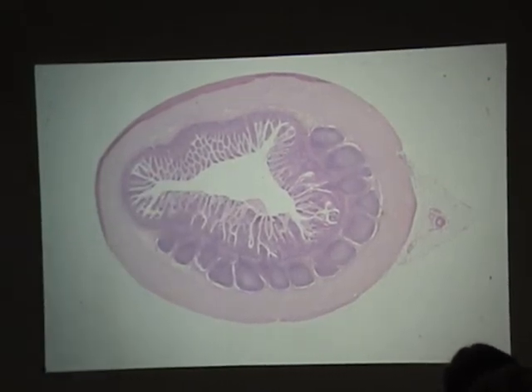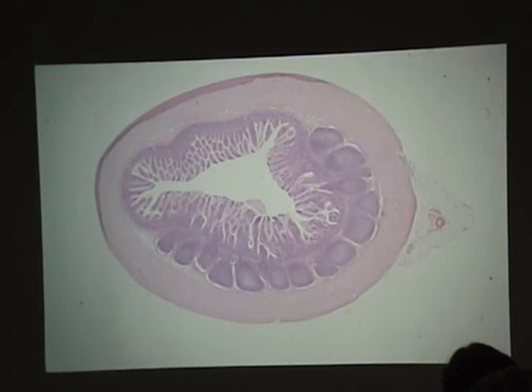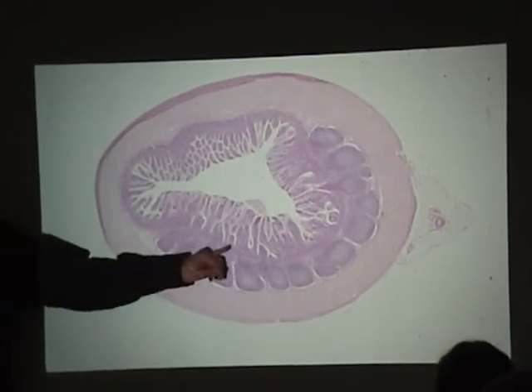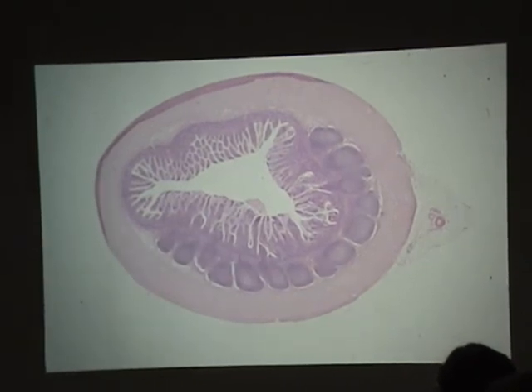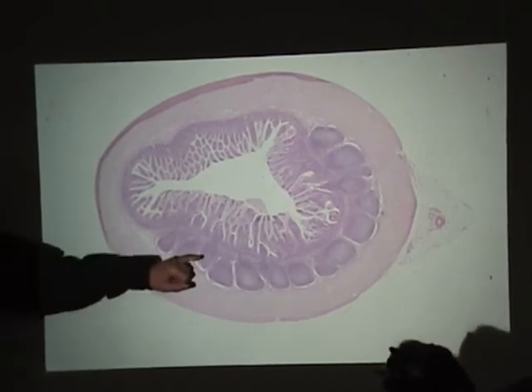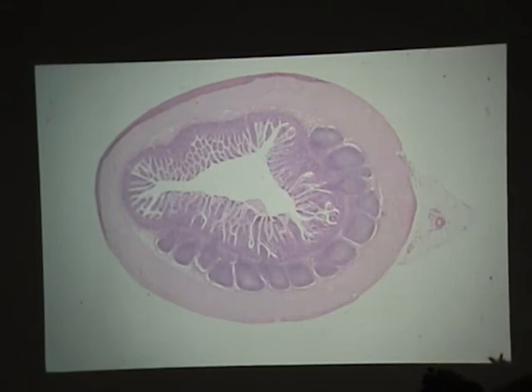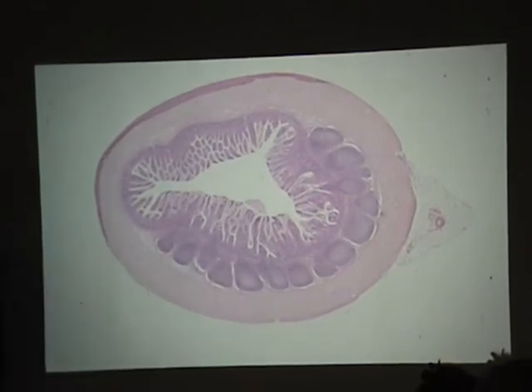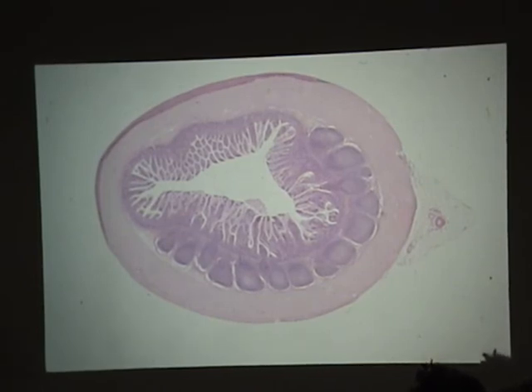Before we talk about Peyer's patches, let's do the organization of the gut wall, starting from the lumen. The mucosa consists of the epithelium — columnar, with goblet cells. The connective tissue core of the villus is called the lamina propria, and it's an example of loose connective tissue. There's a thin layer here — a couple of smooth muscle cells thick — called the muscularis mucosa. So the mucosa consists of the epithelium, the lamina propria, and the muscularis mucosa.